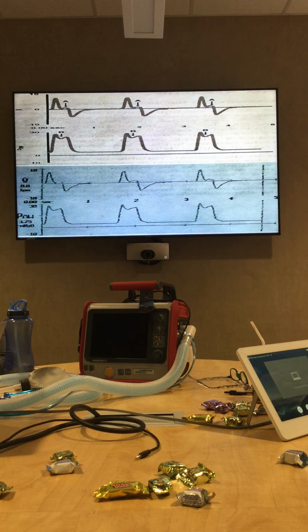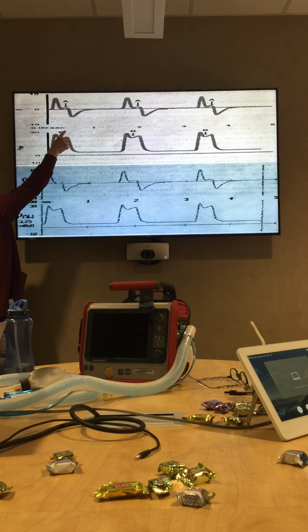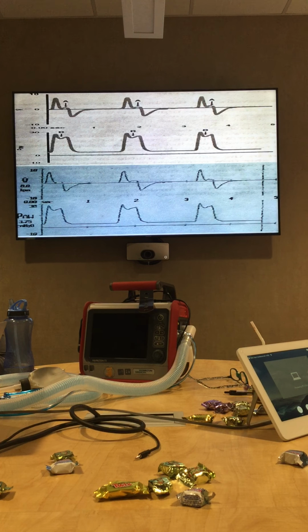So if I look at this patient, A on the top, the top waveform is actually a flow waveform. The bottom one underneath is an airway pressure waveform. So I inhale, boom, come to peak inspiratory pressure, where you can almost see that peak pressure, but I should be peaking here, okay? Because of B, I've actually had too much flow going in. So I'm overshooting that patient. So either my rise time is way too fast.